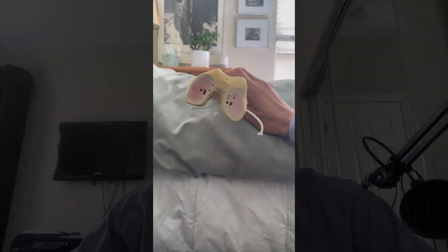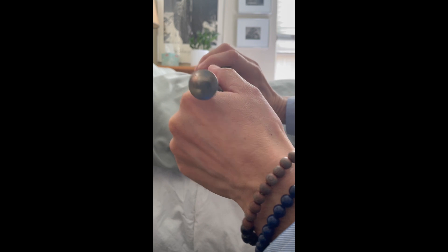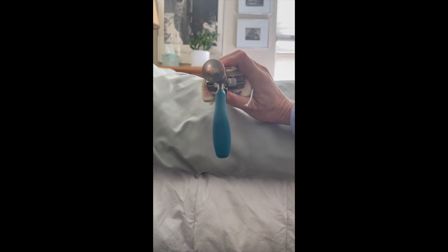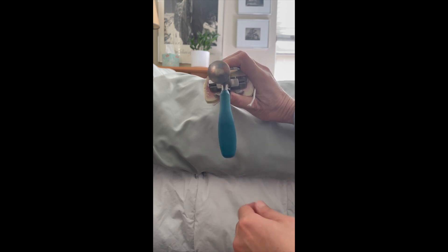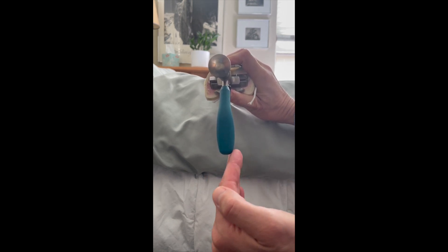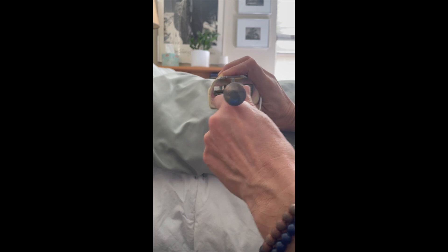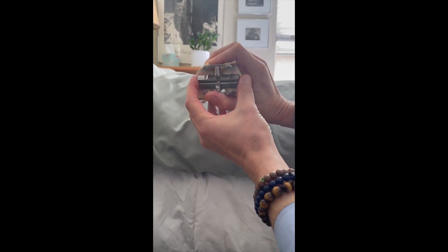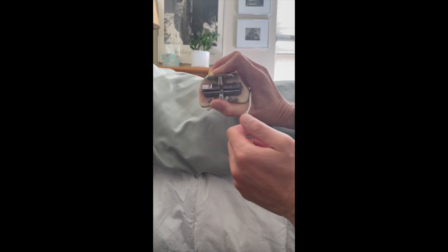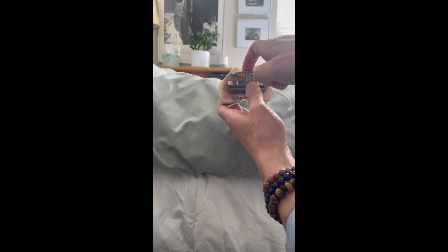Here you have your distal femur — the sawbones is on its last legs. When you drop your four-in-one cutting guide in your hole, this is kind of why I like this system: this handle essentially becomes a little mini drop rod. When you put this in there, you can very quickly look at your tibial axis and make sure you like your rotation. You may have cut your tibia already, but at least this gives you the perpendicular ability to check whether your component is internally or externally rotated in relation to that axis. The next thing I look at is the width — just because you sized it, you want to make sure the width looks appropriate. If the width looks extremely small or extremely big, you may have to second-guess what you thought the size was.